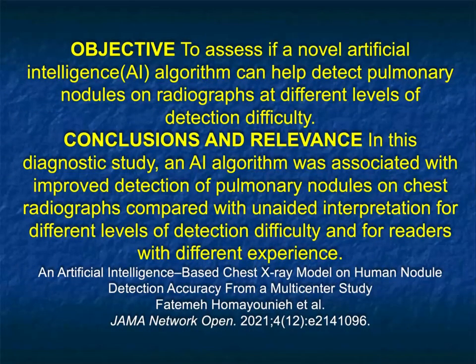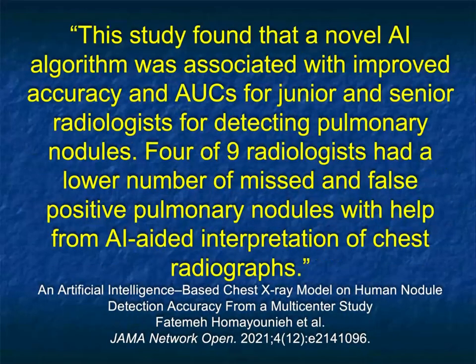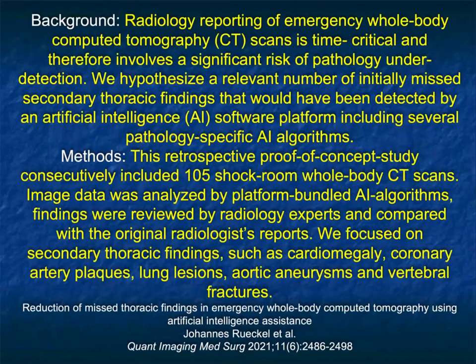Now, in this article by Hamayota, their objective was to assess if a novel artificial intelligence algorithm could detect pulmonary nodules on radiographs. And in this study, the algorithm was associated with improved detection of nodules on chest radiographs compared with unaided interpretation for different levels of detection difficulty and for readers with different experience. So very much like the same results as before. 4 of 9 radiologists had a lower number of missed and false positive pulmonary nodules with the help from AI-aided interpretation of chest radiographs. Again, an aid to help us work.